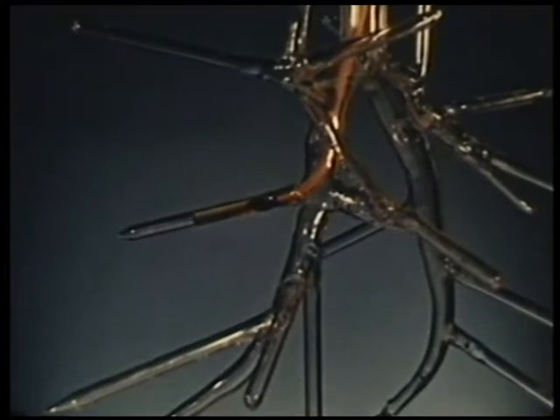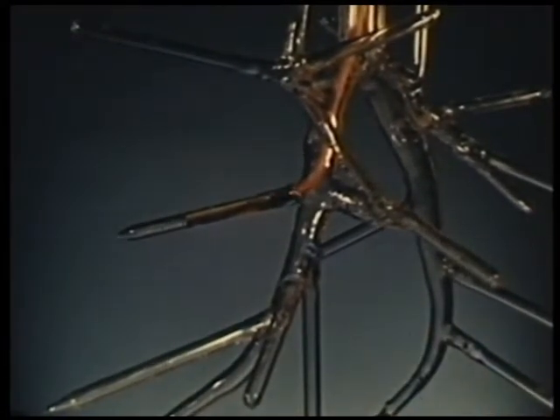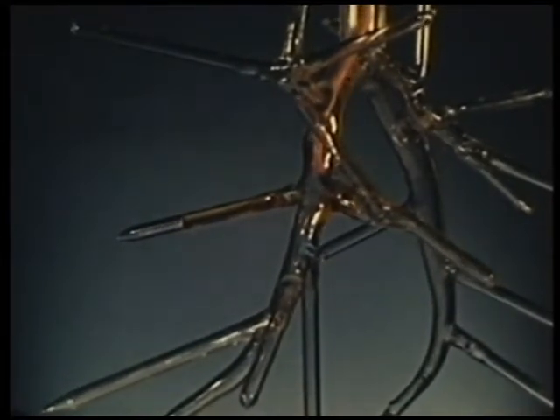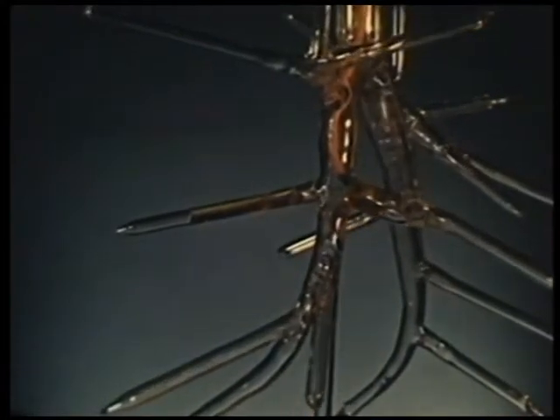Naturally, other bronchial segments can also be demonstrated in a similar fashion. The catheter is withdrawn into the main bronchus. The contrast medium then flows into the middle lobe and lower lobe bronchi.